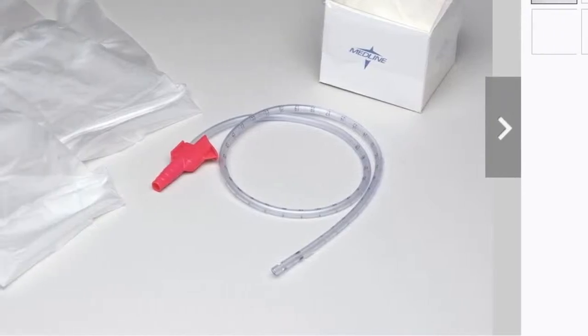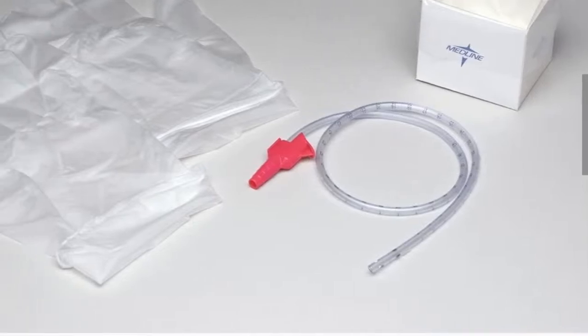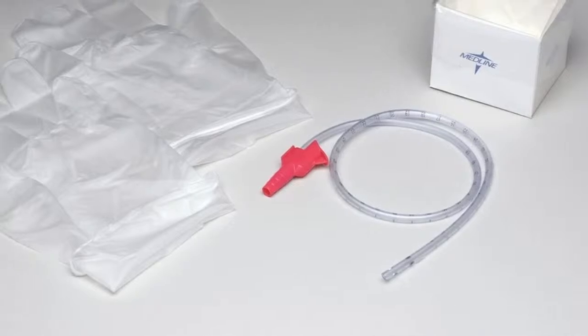Okay, here you go. This one comes in a little package, in a kit. The kit might have, you see that little box right here? This is what you use to put the saline. And these are the gloves that you will be using. Okay? So this one is an open suction catheter. We also call it French catheter.